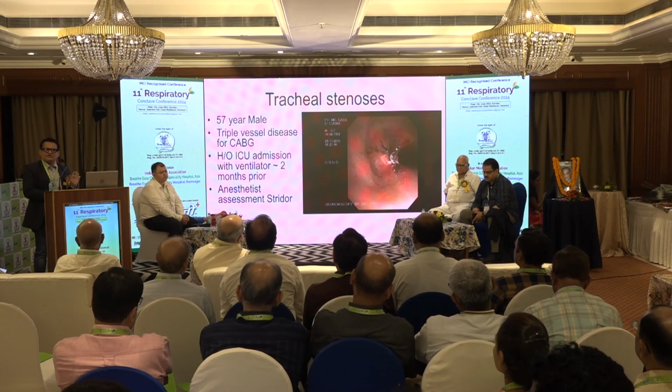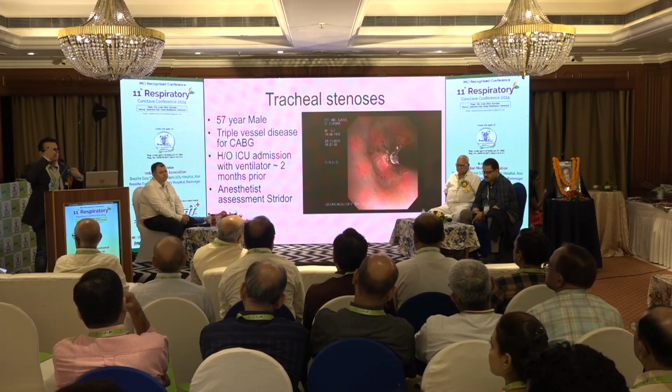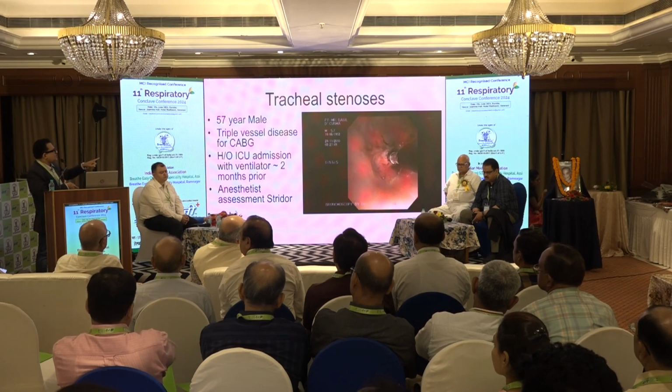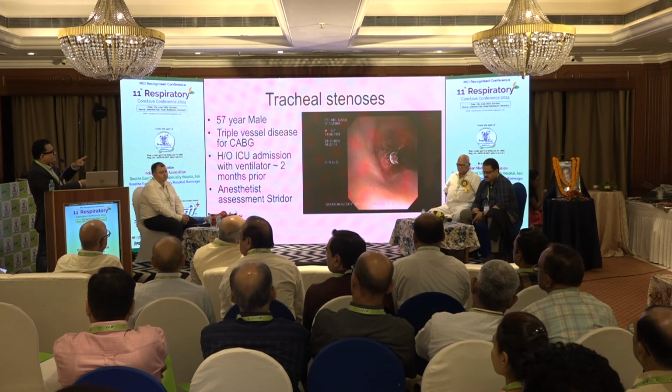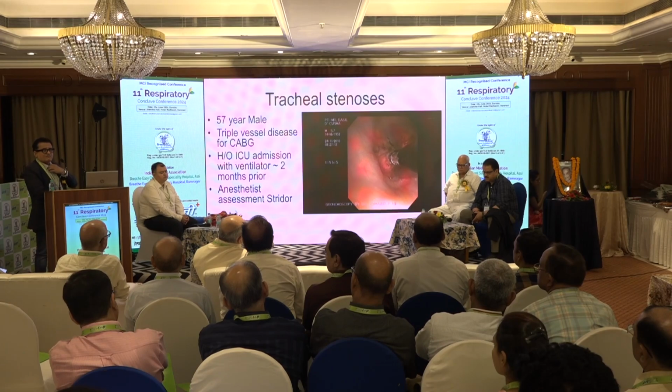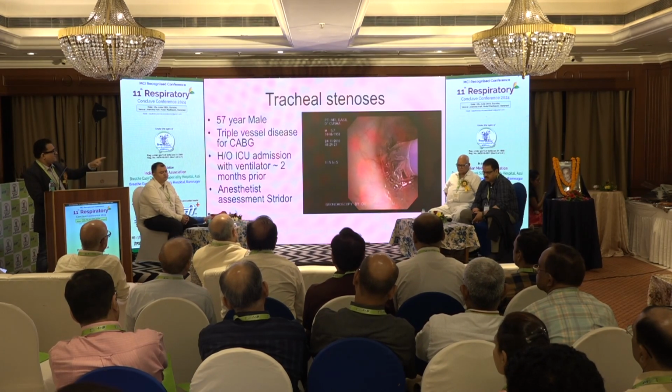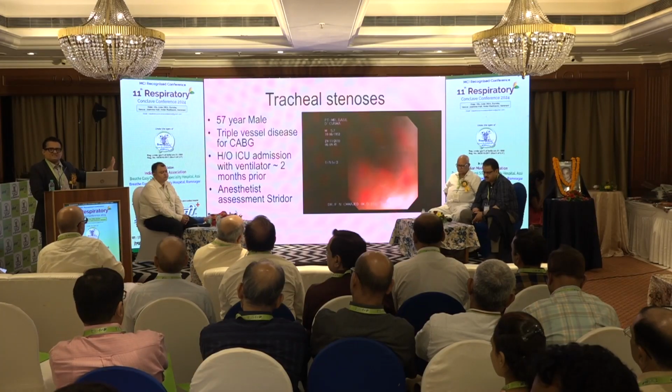Now, a lot of patients undergo ventilation and endotracheal intubation, and you can get airway stenosis. Now, this is a patient, look at that small opening, this is the airway, okay, and this is our main airway, which is 14 to 16 to 18 millimeters in diameter, and this was hardly 2 or 3 millimeters. We can do balloon dilatation, and with balloon dilatation, we can open the airway. This is called a balloon tracheoplasty.